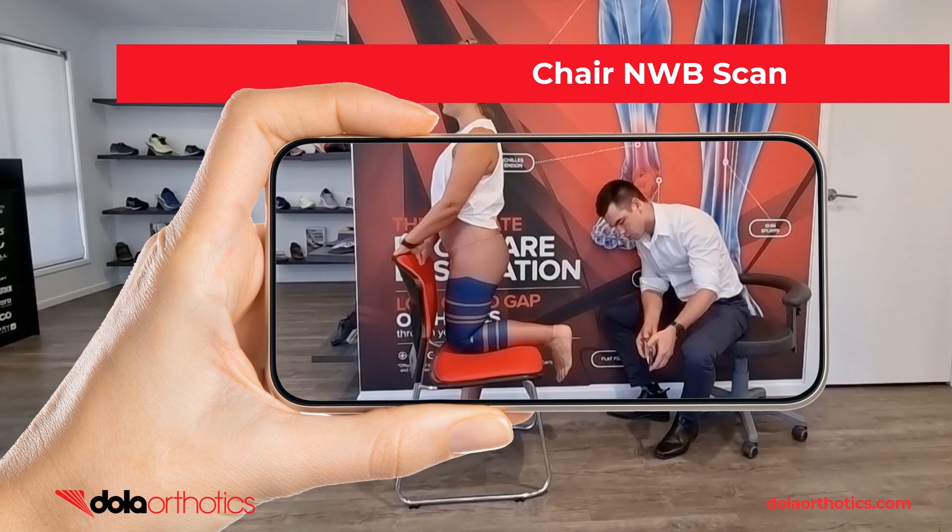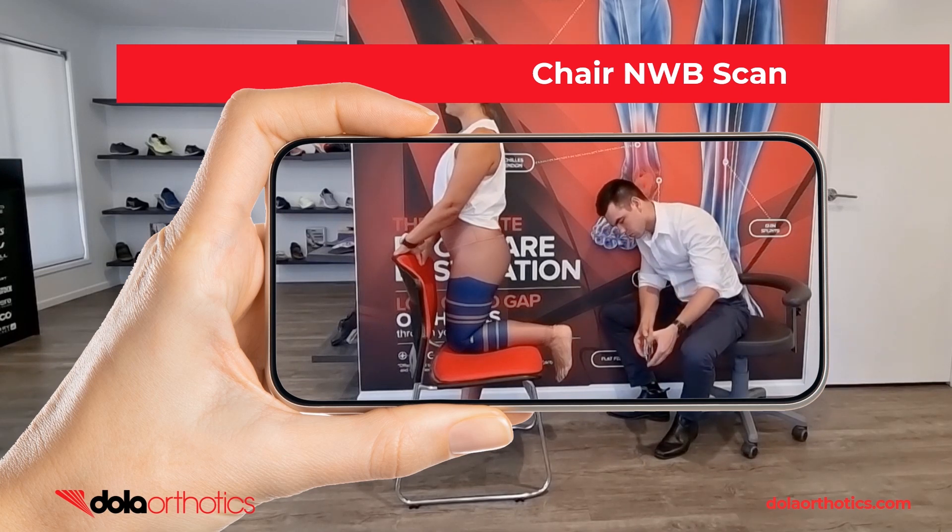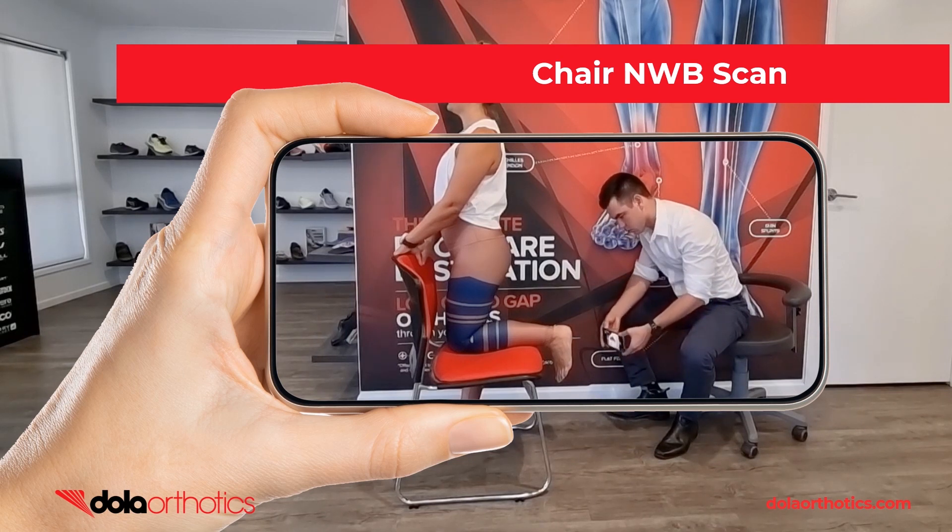Here is a demonstration of the iPhone being used to capture a non-weight bearing foot using a chair to aid patient positioning. Move the phone to capture all aspects of the foot and assess prior to submission.